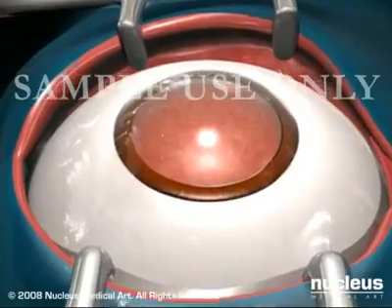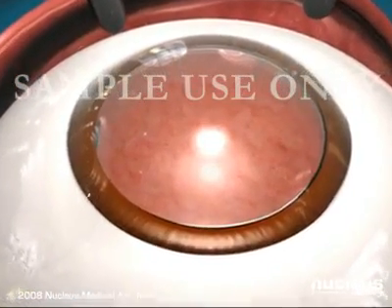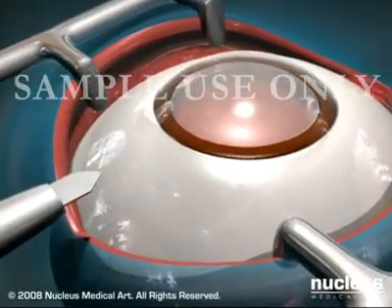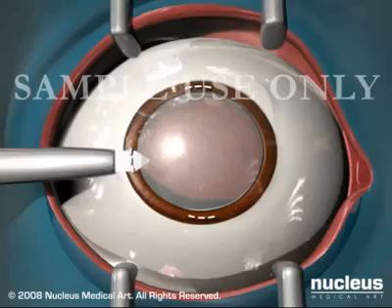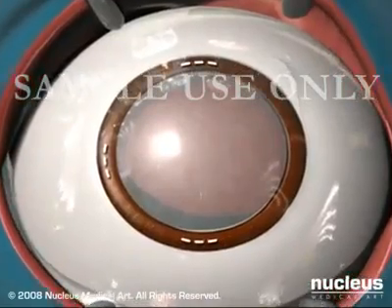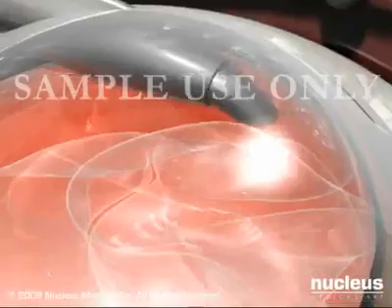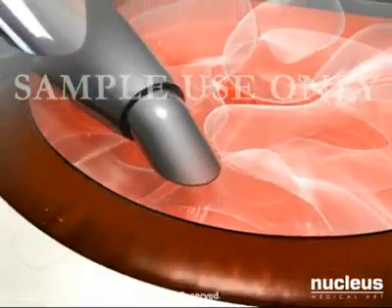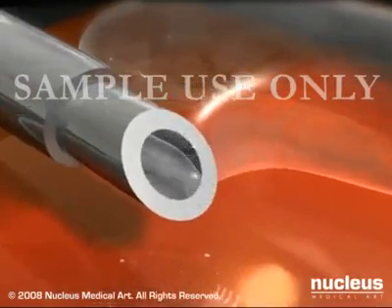The most common method used for removing cataracts is phacoemulsification. In this procedure, the surgeon looks through an operating microscope and makes 3 small incisions in or near the cornea. An opening is made through the capsule of the lens, and an ultrasound probe is used to break the cloudy lens into tiny fragments. These fragments are vacuumed out through the incisions.